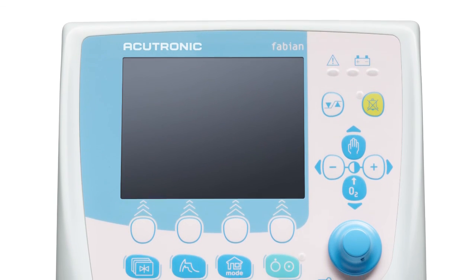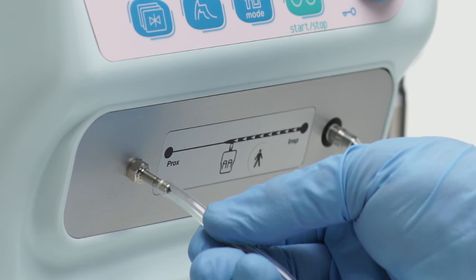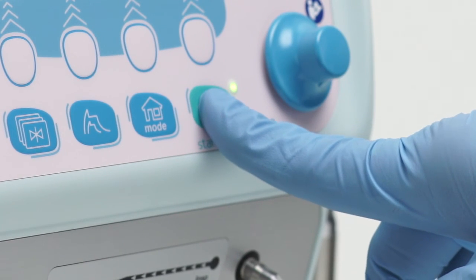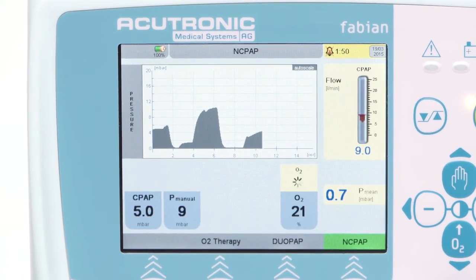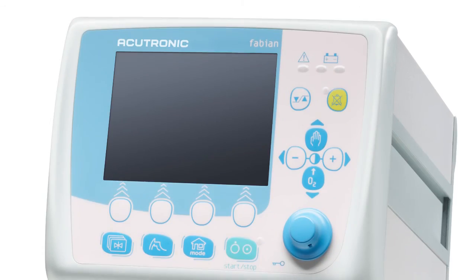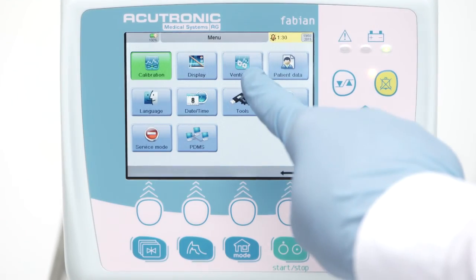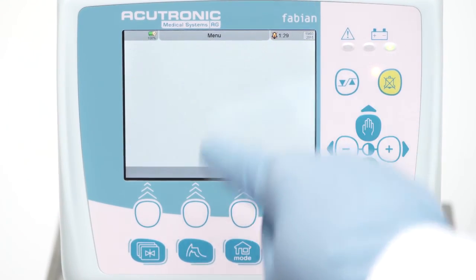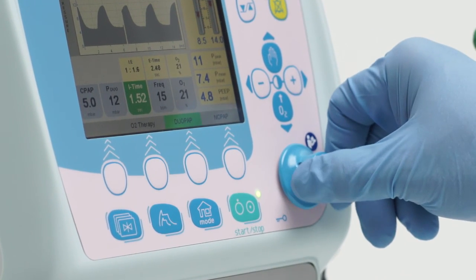Welcome to the Acutronic Fabian Therapy Evolution training video. The Fabian Therapy Evolution is an electronically microprocessor controlled ventilator, intended for premature infants, newborns, as well as children weighing up to 30 kg. It is suitable for inpatient use in hospitals, medically used rooms, and intra-hospital patient transport.